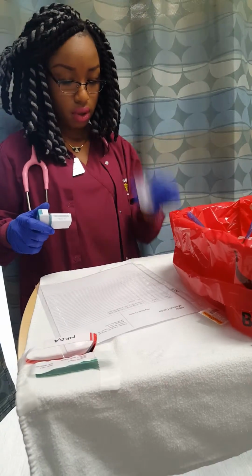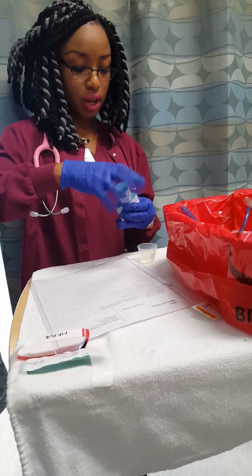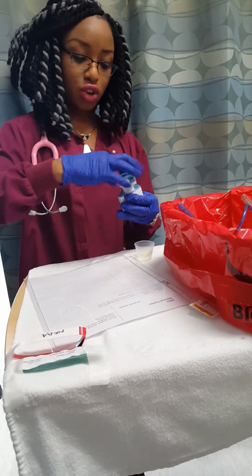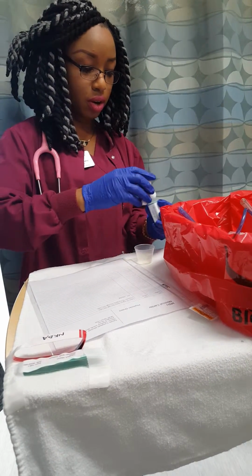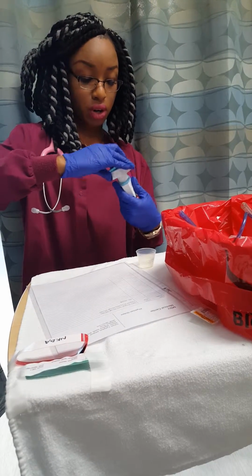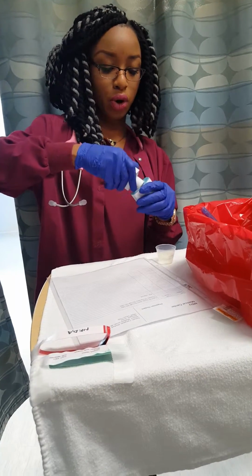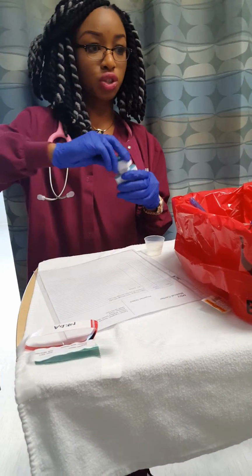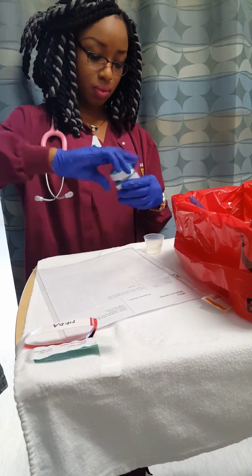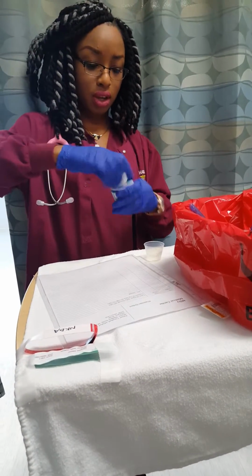Okay. Get my little cup. Pour it in here. And then you can always dissolve it with water, hot water, or normal saline. Or probably hot water would be better to dissolve it, not to flush it. So making sure it's crushed up properly.